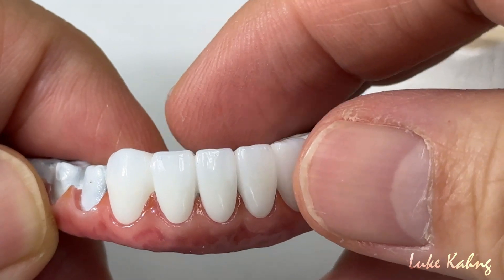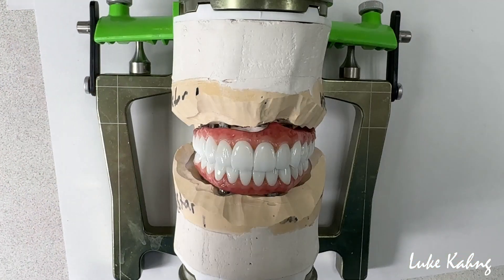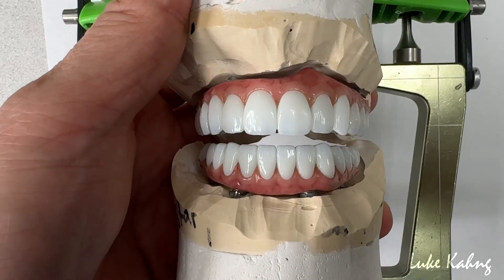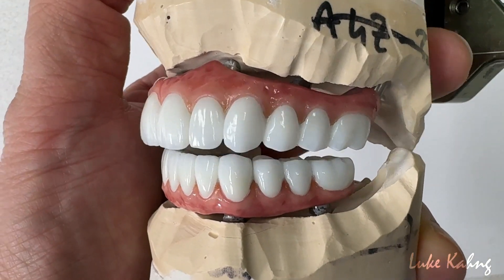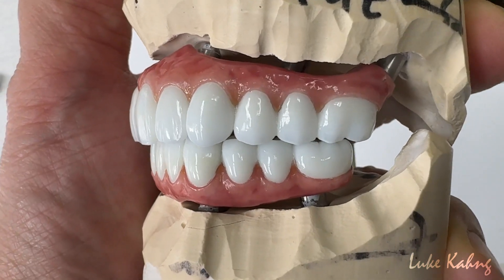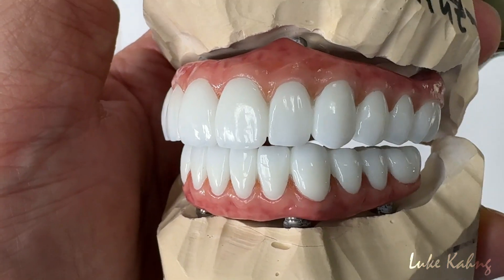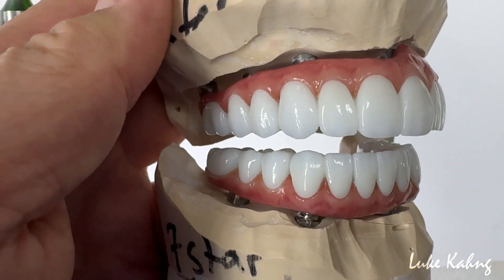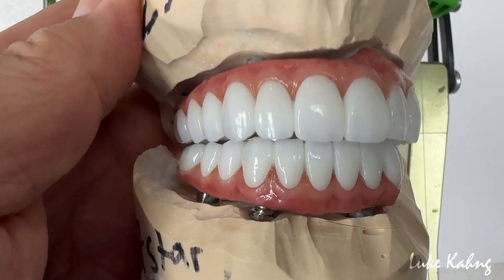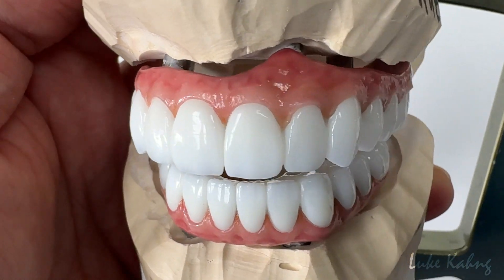We took it out from the model. After cementation, with the mounting, just make sure the occlusal contact is on. Give them the maximum strength. Pure white — slightly more white — because it's white actually. And finish the final restoration from this journey.